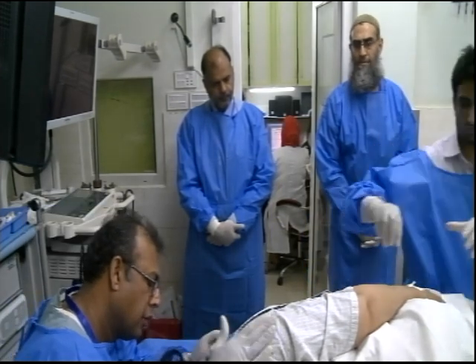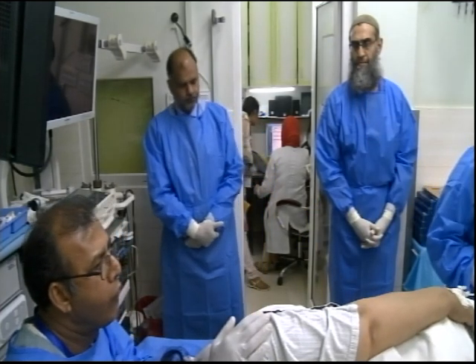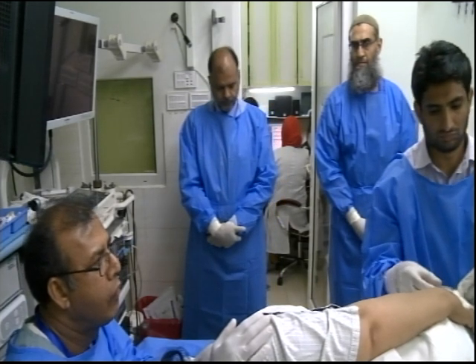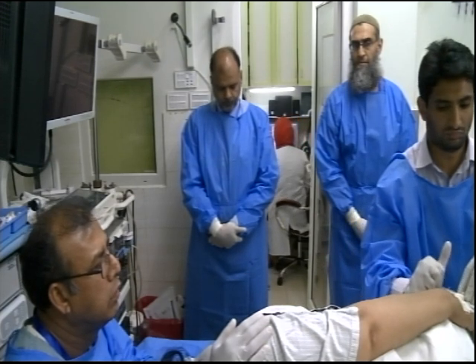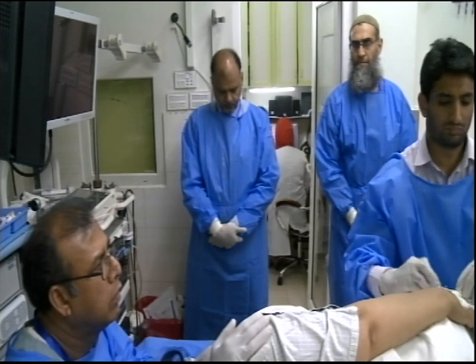Dr. Amjad, first of all, we have an endoscopic look of the lesion, and then we place the endoscopic ultrasound probe on it, and they'll examine the different layers anatomically and look for the involvement or its penetration and rule out other differential diagnoses.